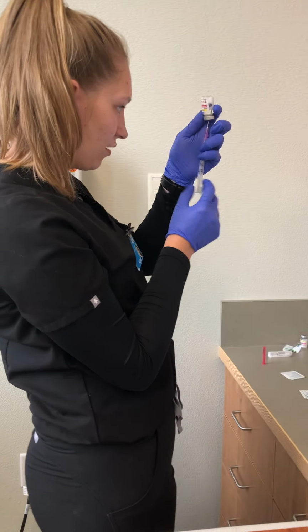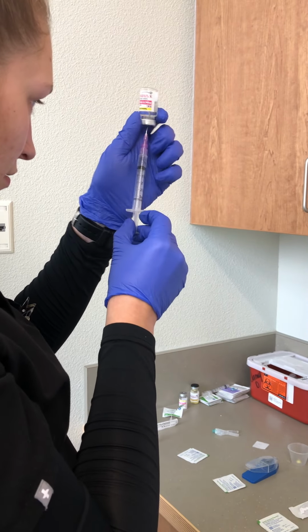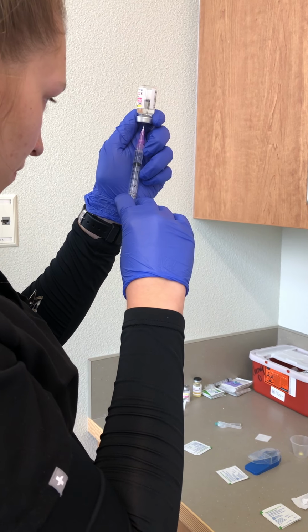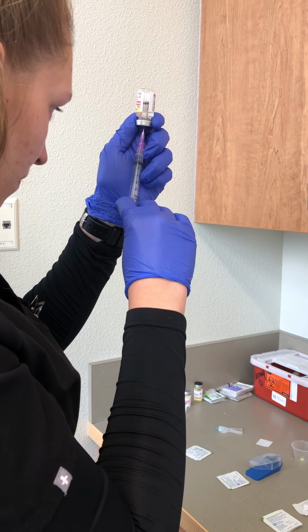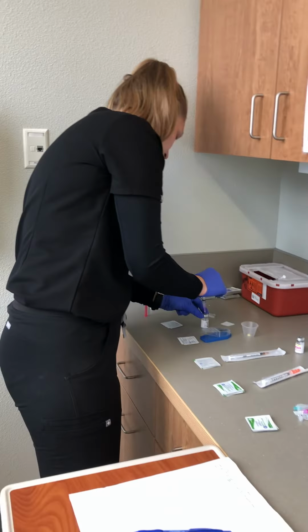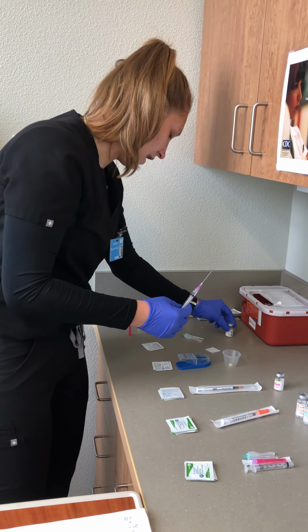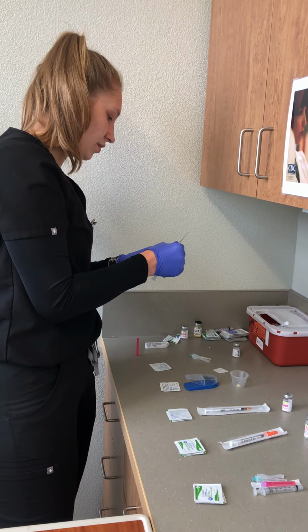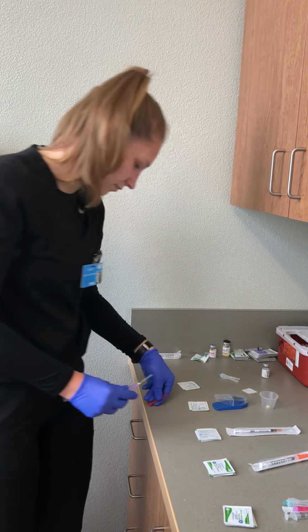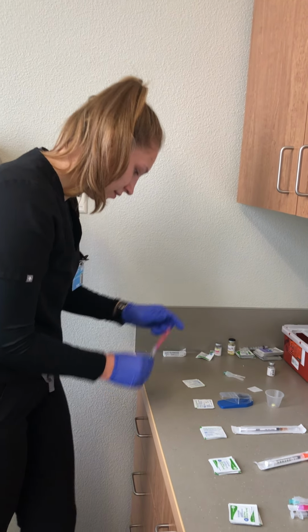Make sure I get out any air bubbles. Okay. So I'm going to pull that out. Going to recap this right here using the swoop method.